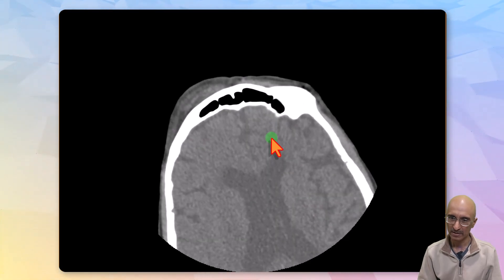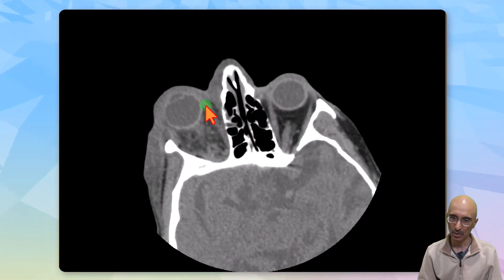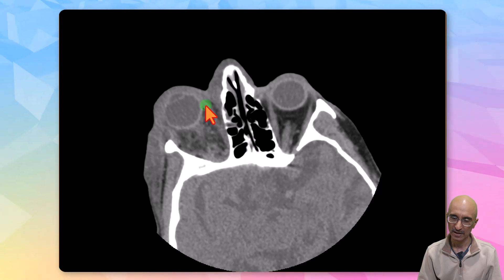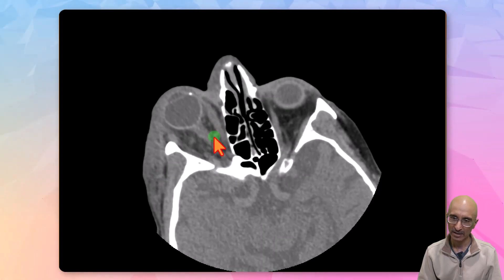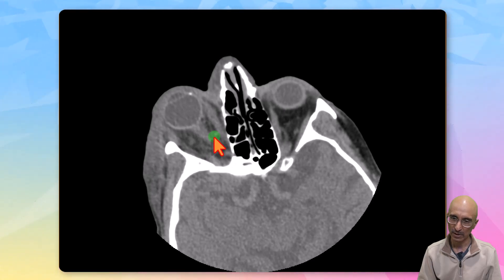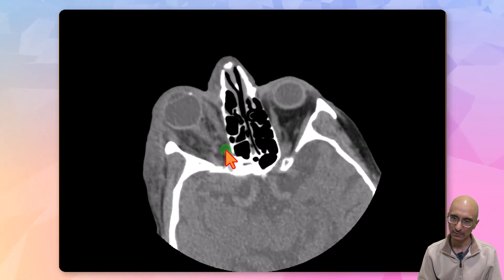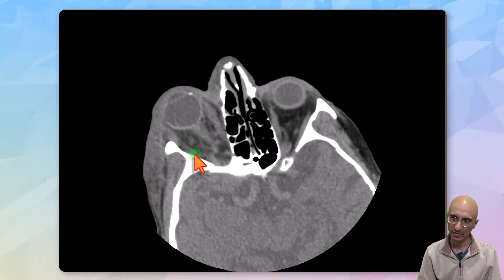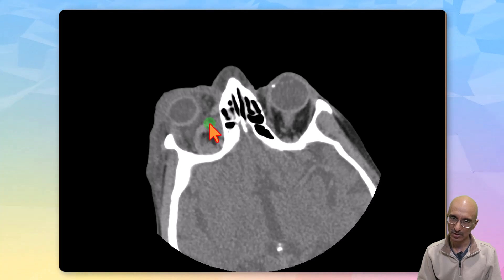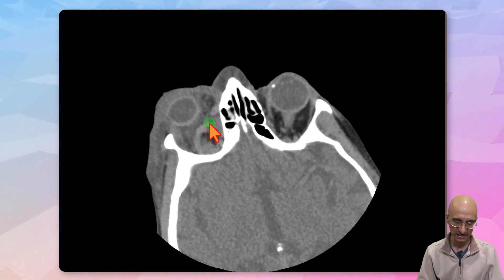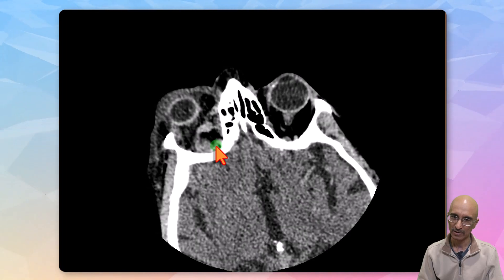On the CT orbit examination we can see there is right-sided proptosis, subcutaneous edema in the right pre-orbital region. We can also see retrobulbar soft tissue edema, and as I scroll back and forth we can see asymmetric thickening of the extraocular muscles. We can also see an engorged, asymmetrically dilated, hyperdense superior ophthalmic vein on the right side.